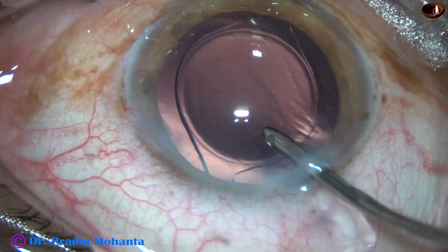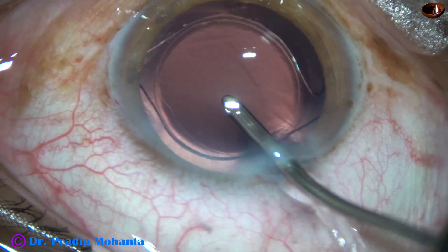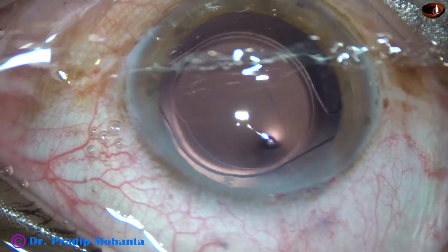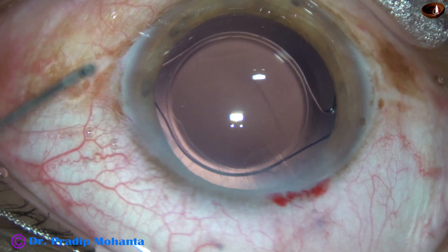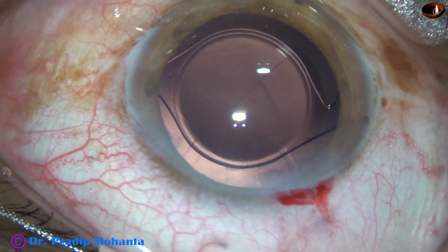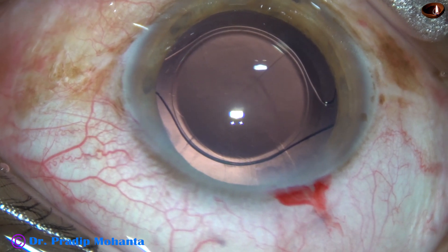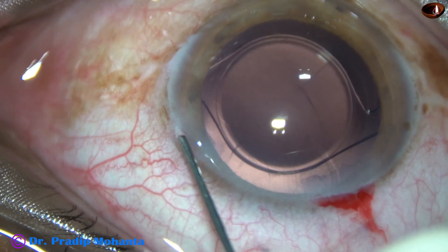The size of the wound is about 3 mm now. The capsule is overlapping in some areas; in some areas it is not overlapping. It doesn't matter at all — the haptics are in the bag.